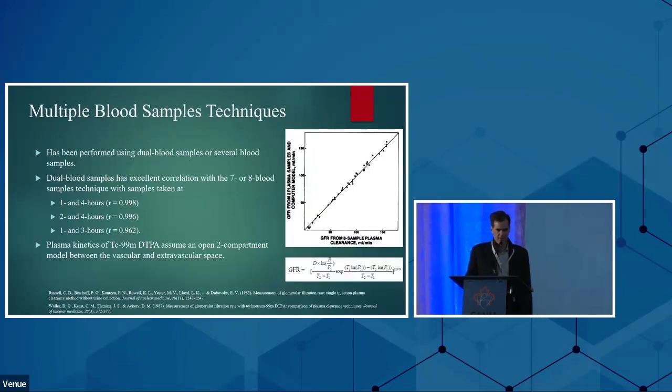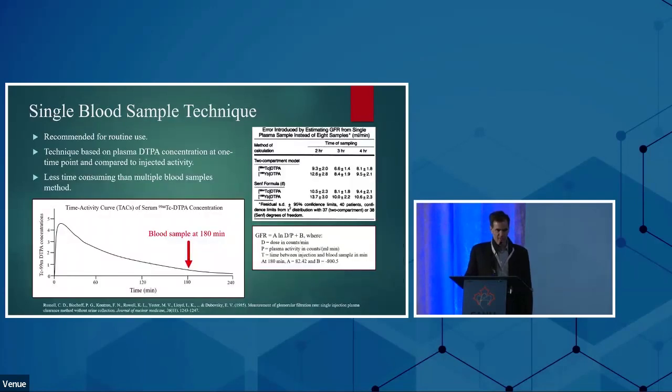There is a good correlation between 8 samples and 2 samples. So it is considered fairly accurate and reproducible. However, it's not the most practical method to use. And then at the bottom, there is a complex formula that I do not want to go over in great detail.